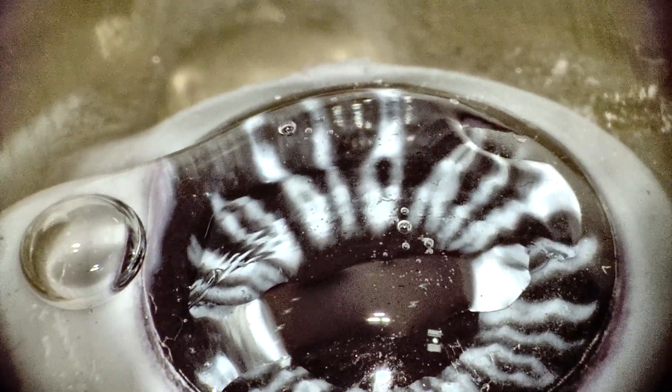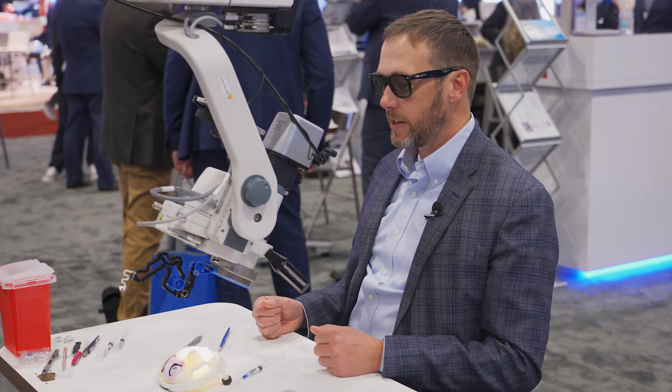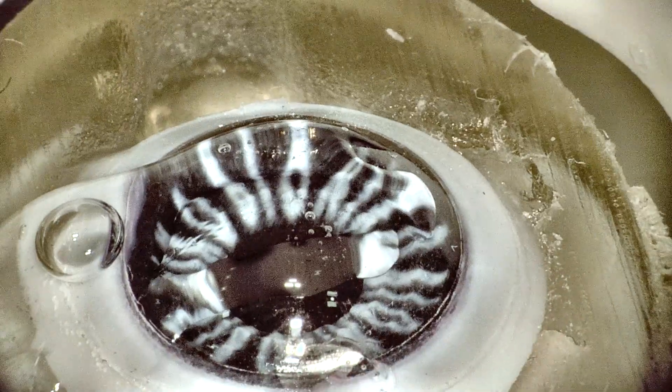Once we get zoomed in, we're going to adjust our scope here and get a good focus on that nasal iris. If you get a nice focus on the nasal iris, once you put the gonio down you're going to be pretty well in focus where you just have to do minor adjustments from there. If you don't do this, you may end up far out and it's a little bit harder to get yourself back to the right focus. Now that we're pretty well in focus on the nasal iris, I'm going to zoom out so we're going to decrease our magnification.